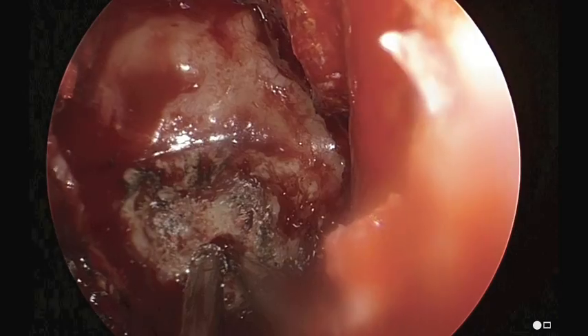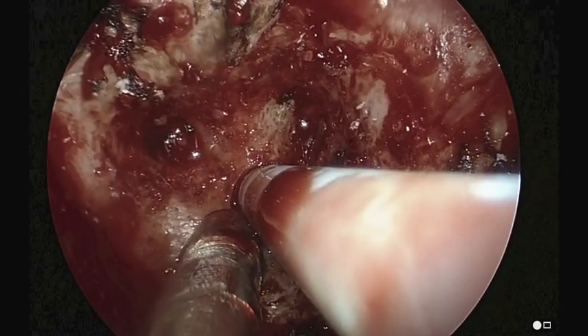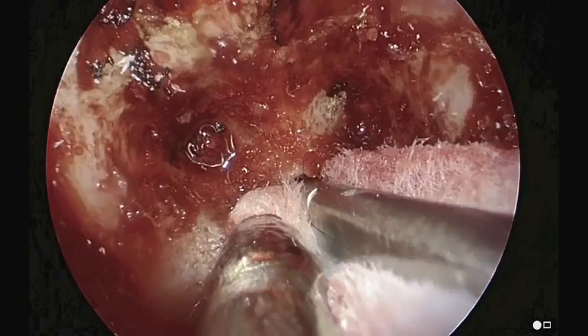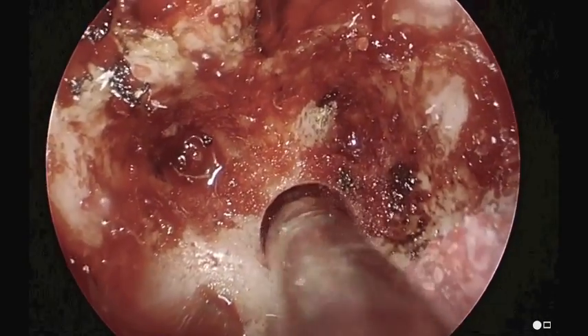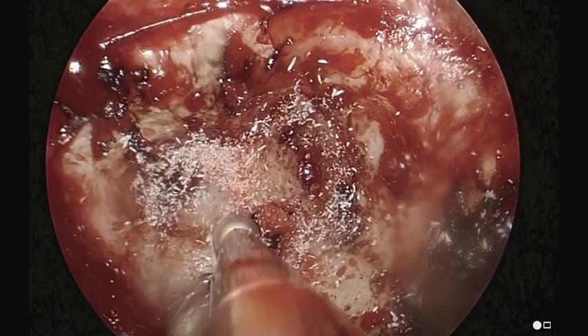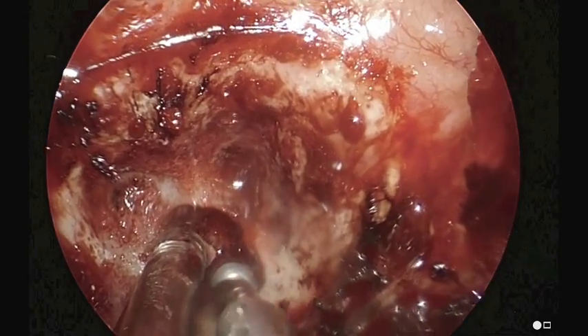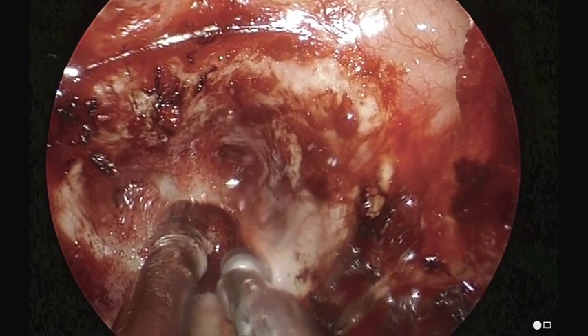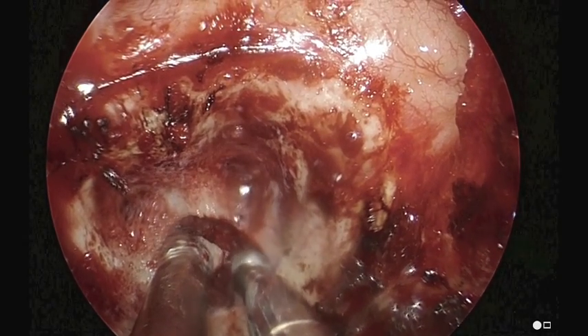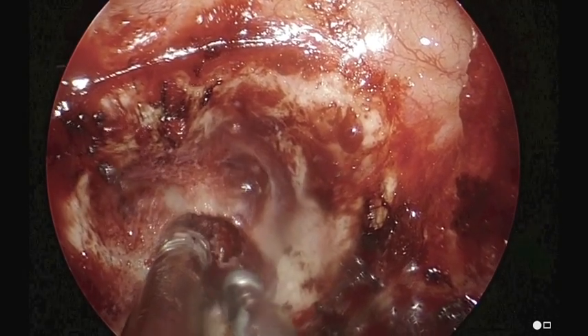As we go more posteriorly on the clivus, there's the dura which is just over the basilar artery. So we don't want to go through the clivus, and yet we want to stick as close as possible to the carotid artery obviously without injuring it. So we're going to be moving towards the carotid on the patient's left side.